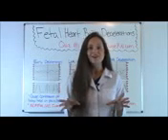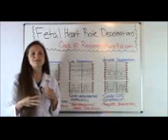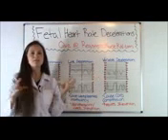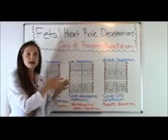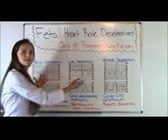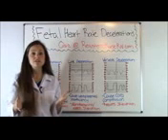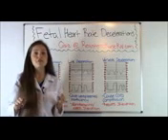So let's get started. Okay, we have 3 different types of decelerations. We have early, late, and variable. First, I'm going to go over the 3 types of decelerations, just explain the difference of how they look, give you an understanding, and then I'm going to go over them individually and hit the highlights of things you'll need to know for your exam.